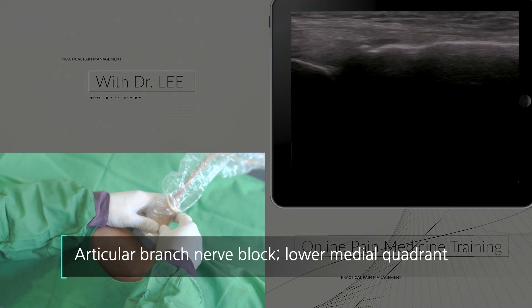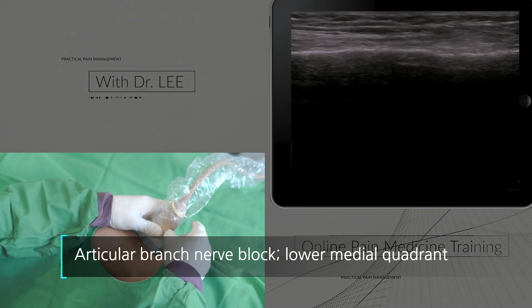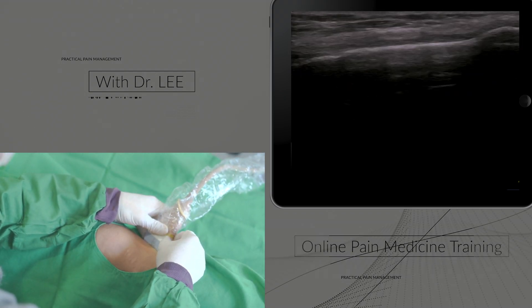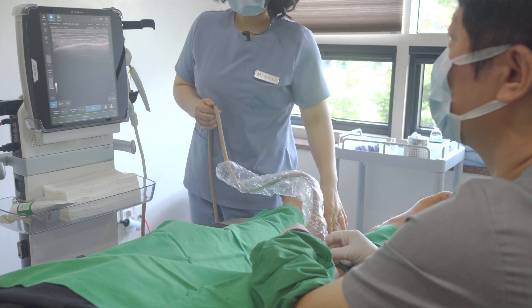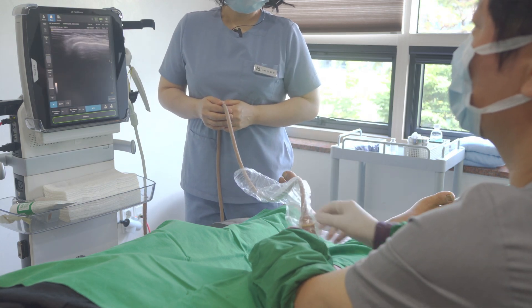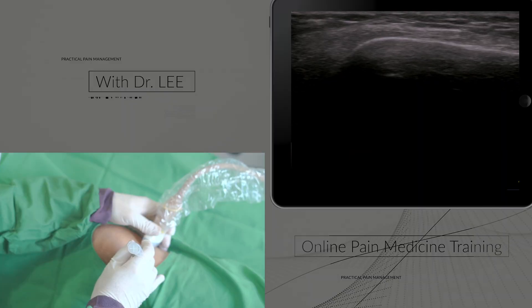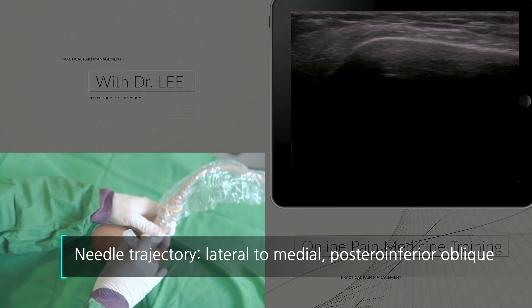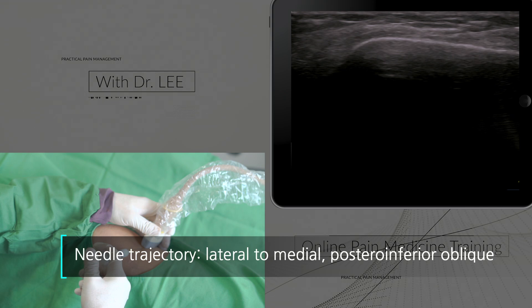This approach is the lower medial quadrant articular branch nerve block. In this technique, I aim to block the inferior medial genicular nerve. I put a needle at the medial aspect of the knee and approach the needle from lateral to medial inferior.